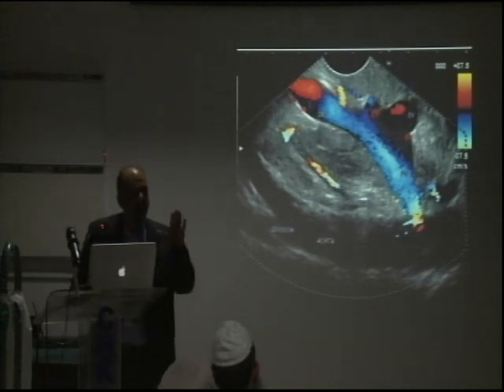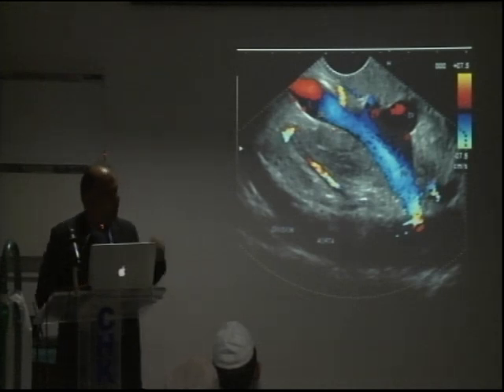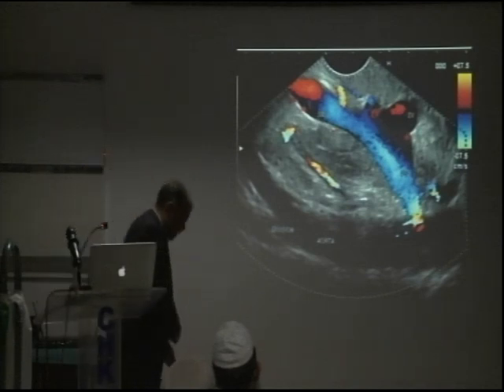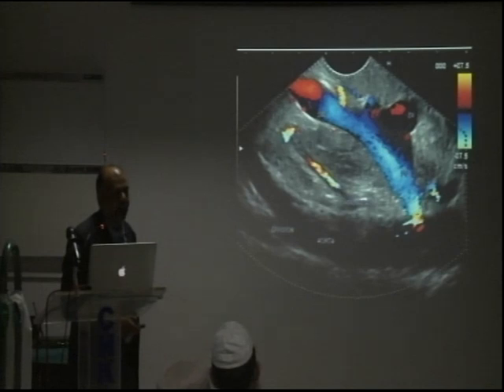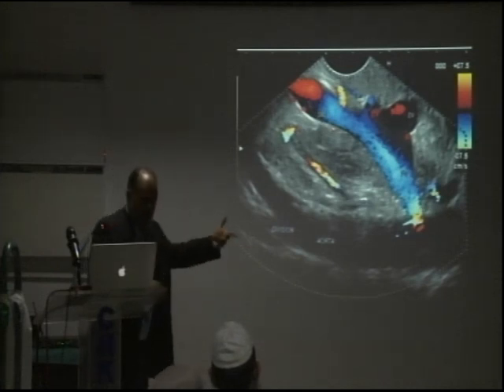Exactly. Now that is the reason. So is it okay or not? Okay. Now, if you follow the splenic vein, yesterday, if you follow the splenic vein above and rotate it medially and pull, the maneuver you're doing is pulling it up, rotating it medially, and the splenic vein still remains in view. If it was coming from that side, it would not remain in view, right? So there's now a disconnect between what you're doing and what you're getting here. And the reason for that is because it flips the picture.